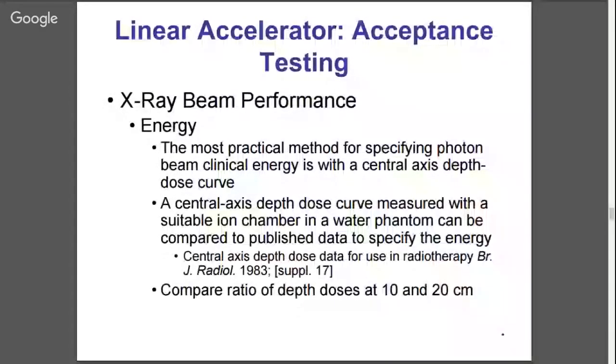Okay. Remember that when we talk about a 6 MV photon beam, that's actually the maximum energy. Remember, we're generating X-rays using a Bremsstrahlung target, so we're going to get a whole spectrum of energies. And that nominal energy is effectively the mean electron energy onto the target, and then we get this whole spectrum, and there'll be a maximum energy, which will be the nominal energy of 6 MV, for example, and then the Bremsstrahlung distribution.